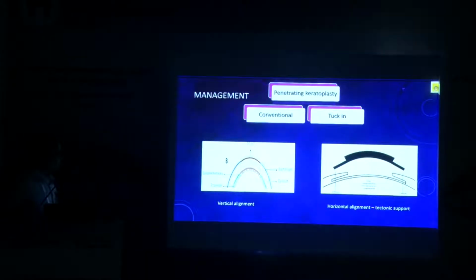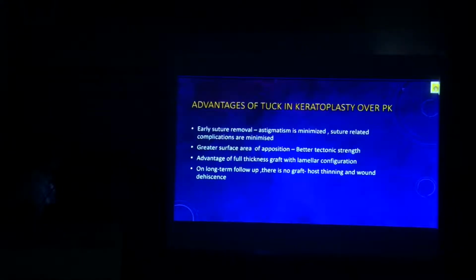So we plan to do a penetrating keratoplasty with a new technique which is called tuck-in keratoplasty. The advantage of this is the suture removal can be done as early as 6 to 7 months. The astigmatism is minimized and all the suture-related complications are minimized.